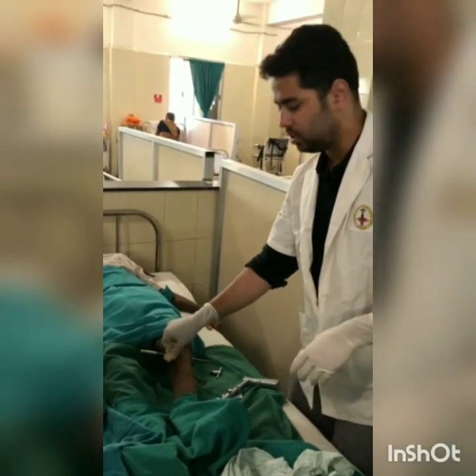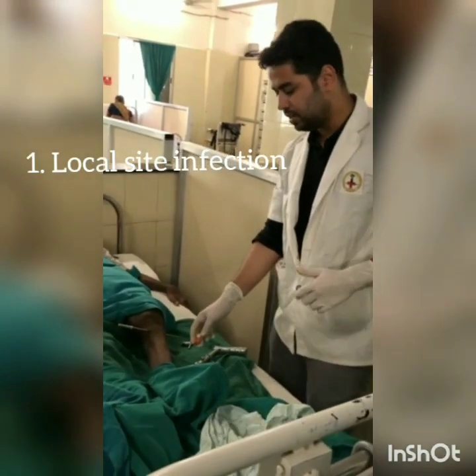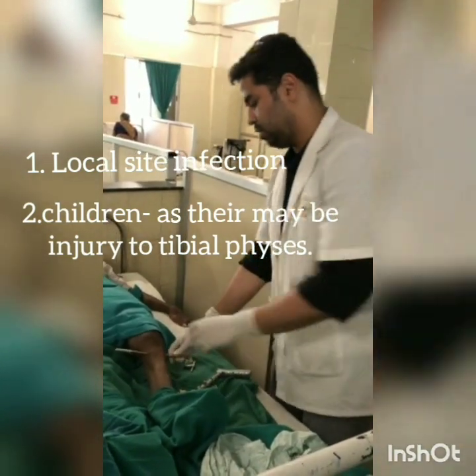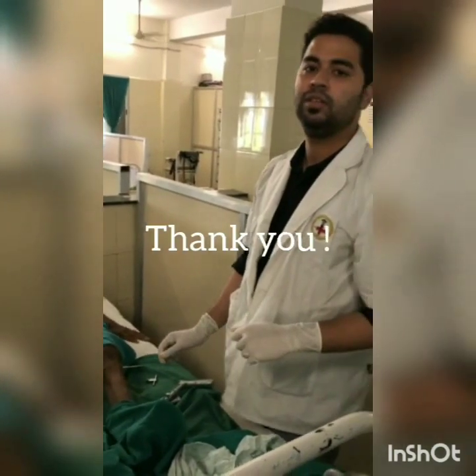The contraindications for the procedure are any local site infection. In children, we do not do tibial pin traction, as there may be injury to the tibial physis. Thank you.